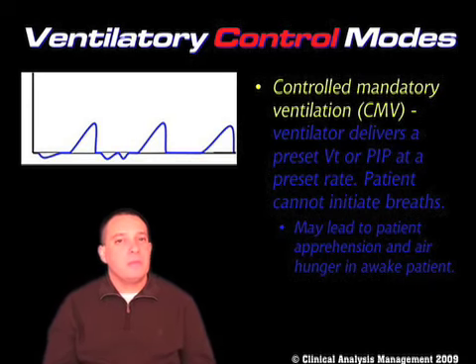Now, again, with the exception of a few types of things like what we talked about, the inverse ratio ventilation, for the most part, we don't use control mandatory ventilation anymore because it's basically a pretty archaic, pretty cruel way of ventilating patients unless we keep them completely snowed.